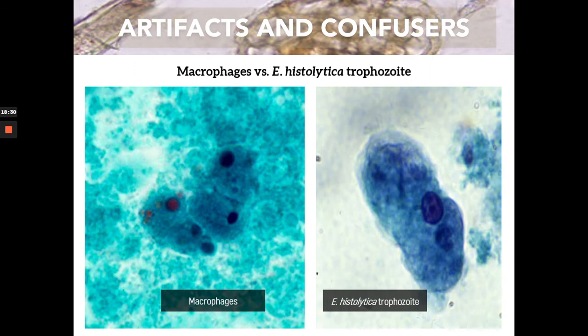WBCs are one of the most challenging structures to distinguish from amoebic cysts. Look for defining characteristics of cysts — chromatoidal bodies and the karyosome. If it's still difficult, stain with iodine using the D'Antoni's method, which can better visualize amoebic cysts.